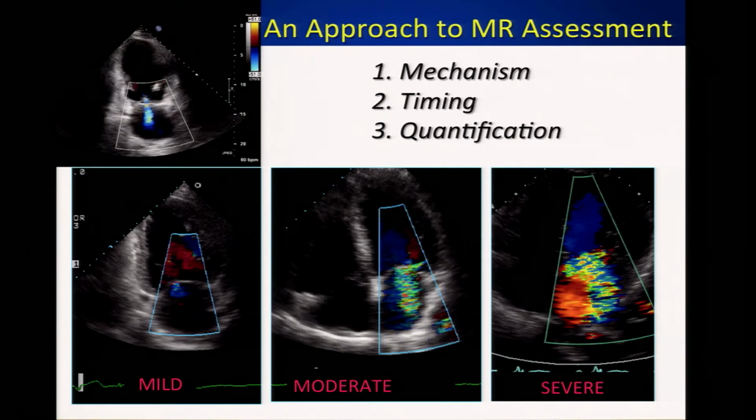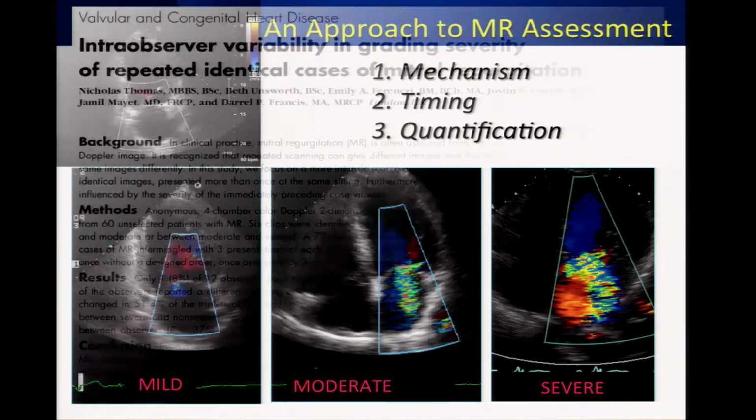In the valve clinic, we see referrals from all over the country, all over the state, and it's incredible how often the echo report will say, structurally normal valve, severe regurgitation. Structurally normal valve, everything's fine except the function is completely backwards. That's just nobody stopping and taking a second and making the connection. You've got to explain why there is this leak, not just say how bad the leak is, okay?